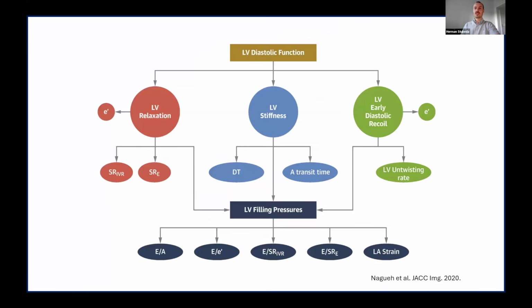There's actually a whole slew of echo parameters that have been shown to correlate with LV filling pressures. Many of these are fairly novel, and they're not used in day-to-day echo practice and study. A lot of these are difficult to acquire and to capture.